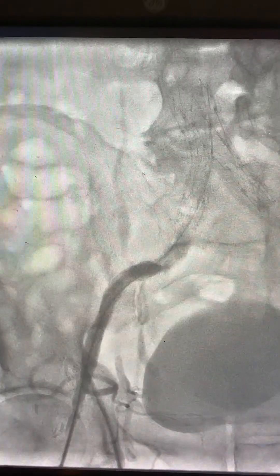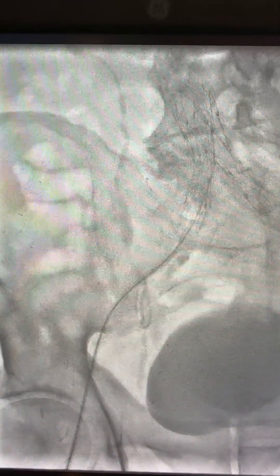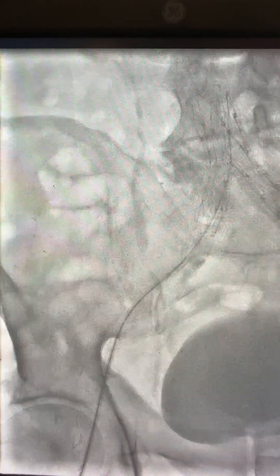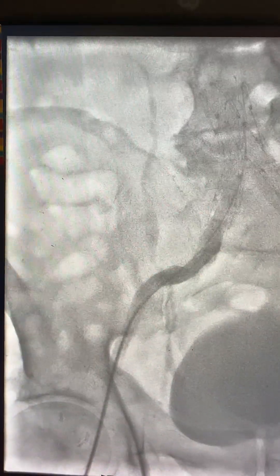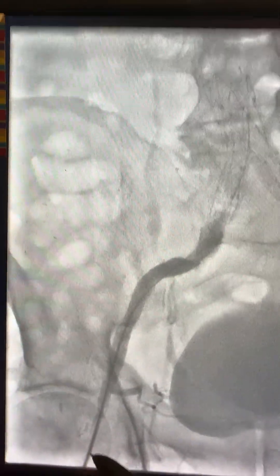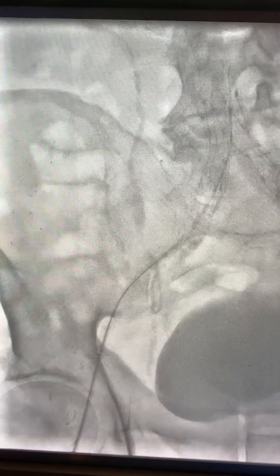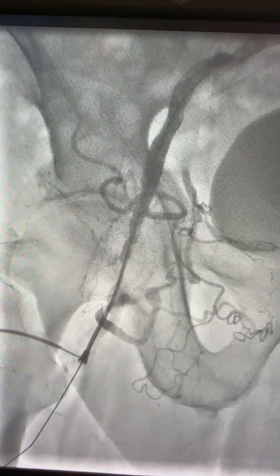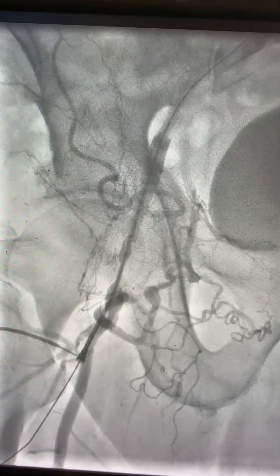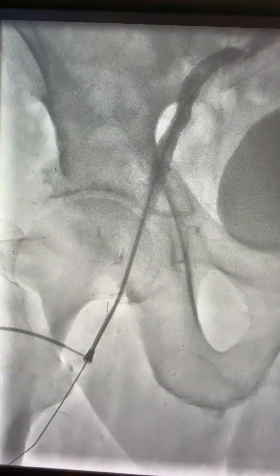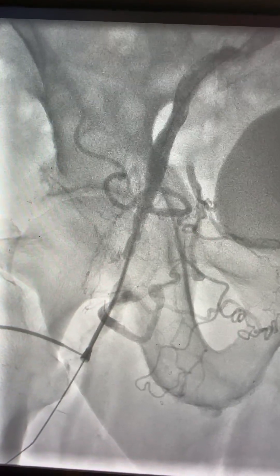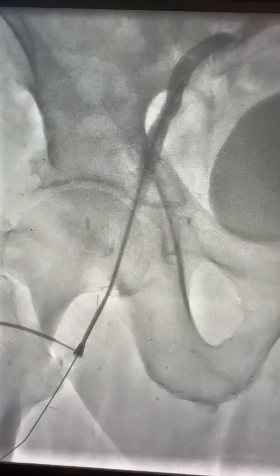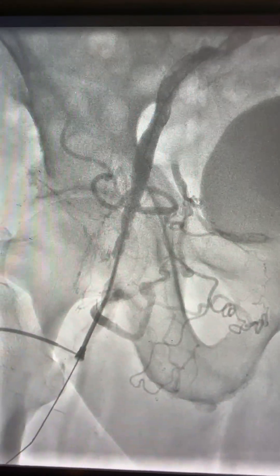This is the angiogram after finishing intervention on the left lower extremity. Using this catheter for injection, you can see the flow stops here because it's occlusive. Pull the catheter, keep the J-wire, and do an injection with the sheath. You can see this lesion — IC or IA nitroglycerin was given and did not improve the flow.